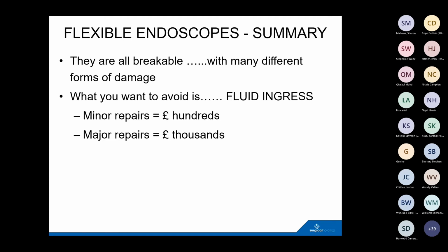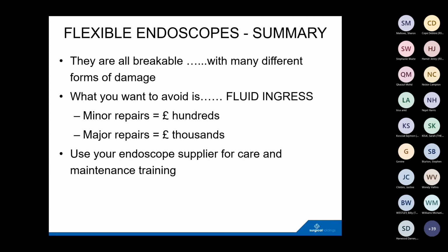But what you want to avoid, and what the manufacturers want to ensure you avoid, is fluid ingress. And certainly, to my knowledge, most manufacturers have care and maintenance teams that will help you with training. So really, whatever your endoscope supplier is, use those teams as you need them, both for cleaning and disinfection advice and from a care and maintenance perspective. Better training will prevent a lot of those expensive repairs.